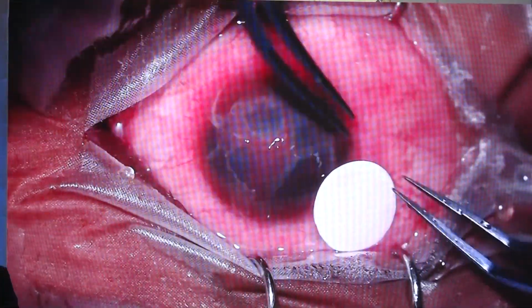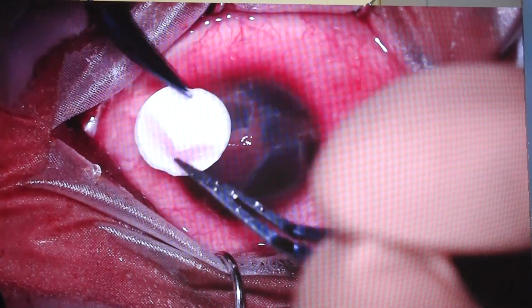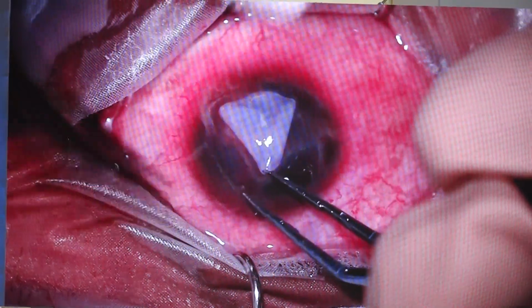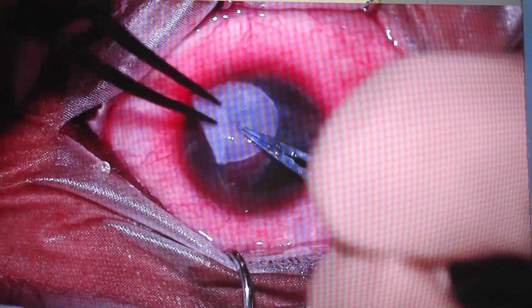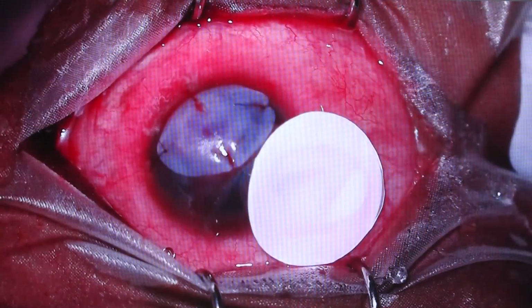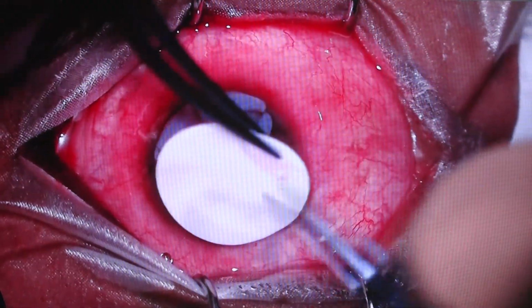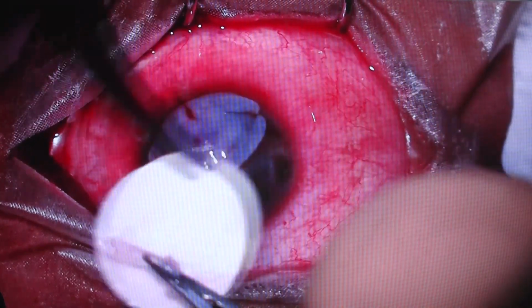So the plan is to cover the crater with a circular patch of AMT and then again cover the entire surface with a larger AMT. Now we are just focused on this. This is the freshly prepared human amniotic membrane which Shoham has shown. Then you just anchor it to the edge by interrupted sutures. And then a larger one, again fashioned from the previous membrane.